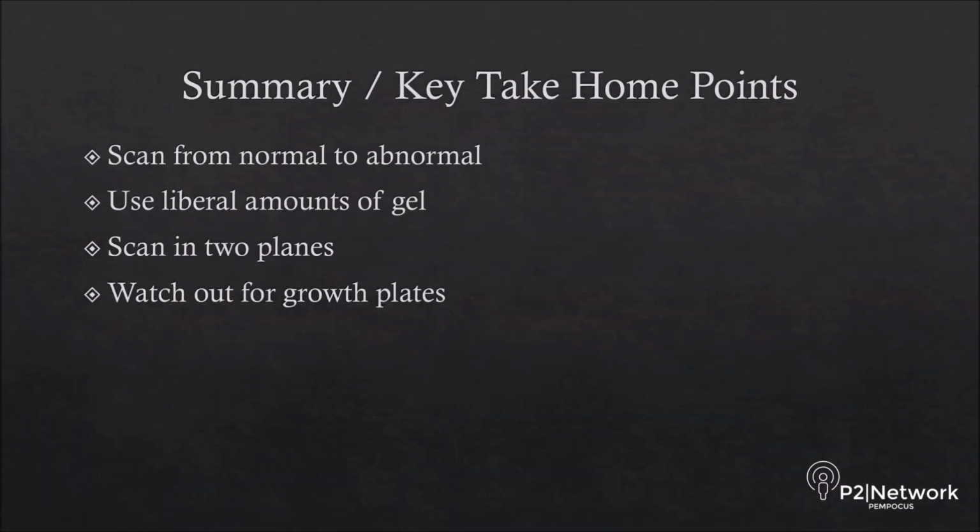So, summary key take-home points. Always look from normal to abnormal. Use lots of gel because it can be painful if you're putting the probe over a fracture. Look in two planes whenever you're looking at bone, and always watch out for the growth plates.